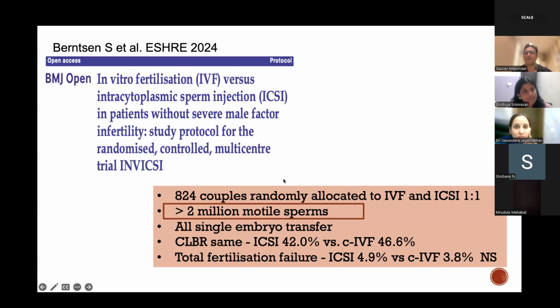And I think the maximum number of eggs is 8 in each well. Okay. In continuation with your study, I just have one more doubt regarding the allocation criteria. So you had the allocation criteria irrespective of whether it was PCOS, endometriosis, or unexplained, or did you exclude a few? Most of them were unexplained with PCO, and some of them were even from other patient groups.